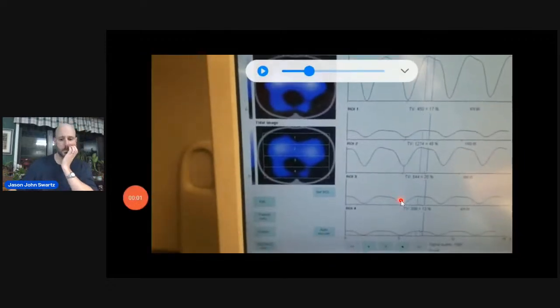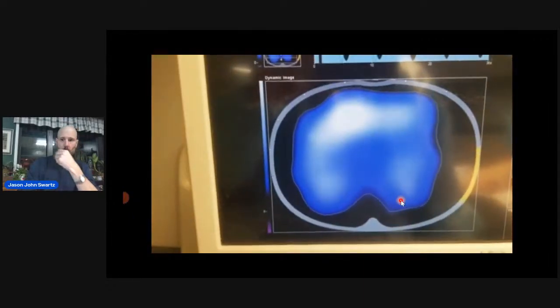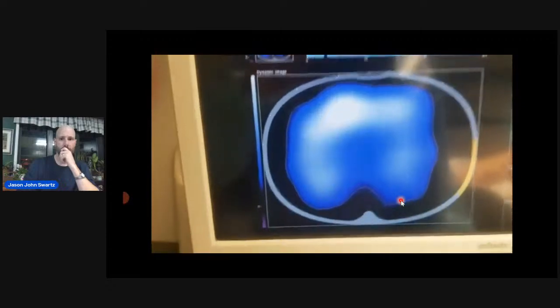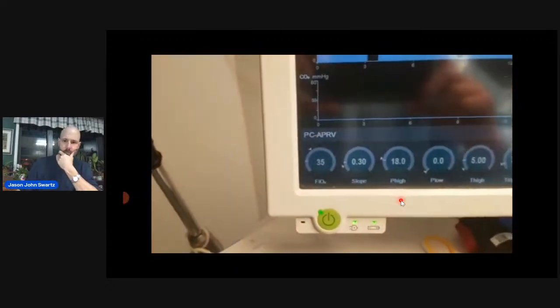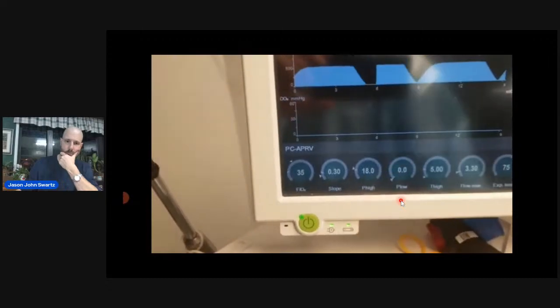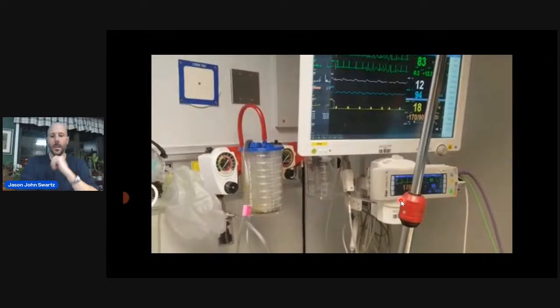When we were in the recovery room having trouble with the dorsal region, and watch this. Boom. I love my job. He's down to 35%. We got a P high of 18. And he's satting 94. Yeah, the person was extubated the next day.